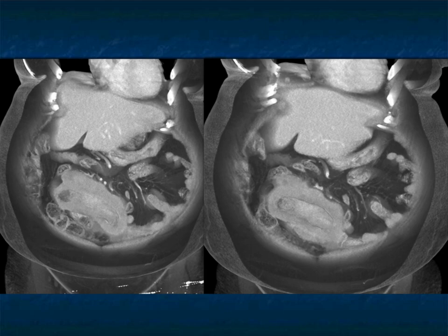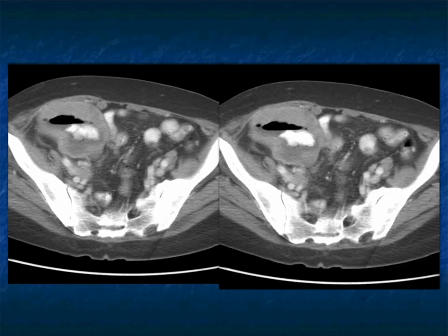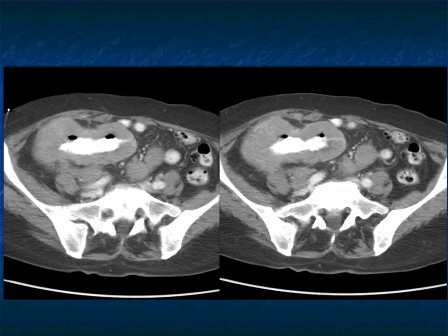Here are some images with contrast in the lumen. These tumors can also bleed. Another example — a bulky tumor with positive contrast involving the small bowel. Less likely adenocarcinoma because of its bulkiness. Classic location: terminal ileum into cecum, very nicely shown. B-cell lymphoma with stranding in the mesentery.